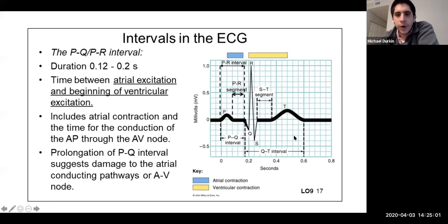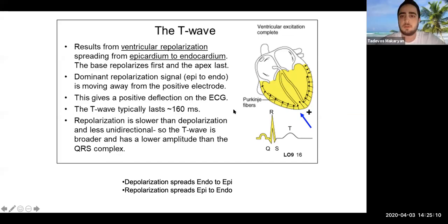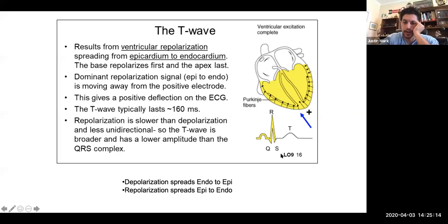So where does the actual contraction happen on the curve? Where on the curve is the heart smallest? Good old QRS. During the QRS, it's contracting. I can't tell you at what point during this wave a particular part of the heart is contracting. I just know that during the QRS complex, the ventricles are contracting because they're depolarizing, and the depolarization signal is making them contract. That's probably the extent of it.